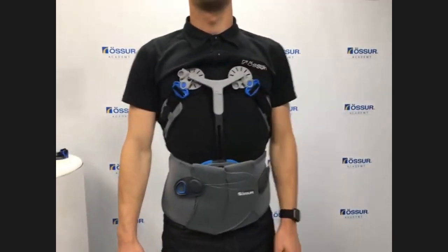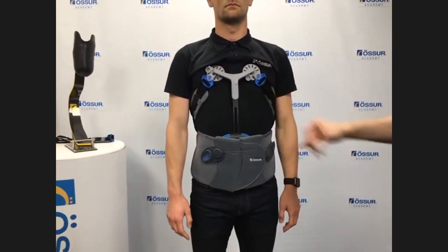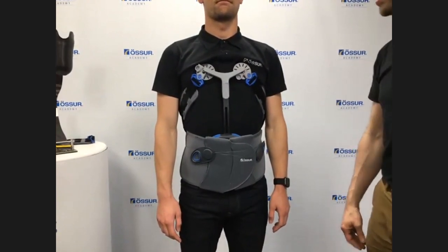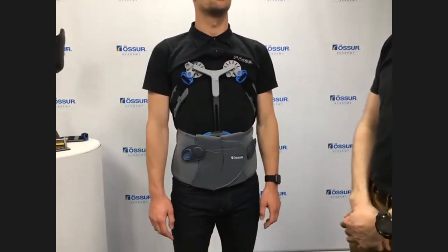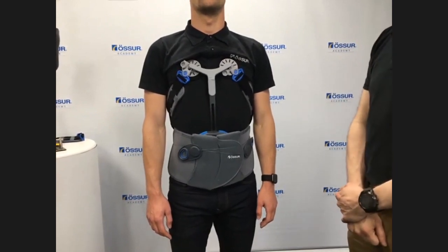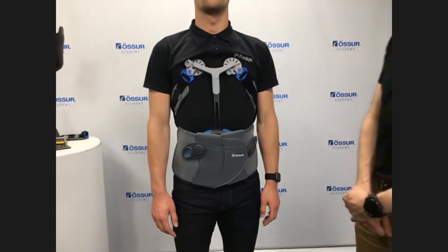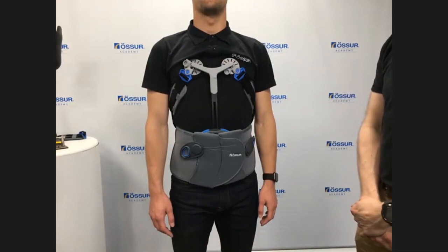Now, one of the good ways that this is stabilizing the patient is you get a much higher level of control over the anterior thoracic extension. So especially in flexion, you're getting very, very high levels of control. It also means that you haven't got those straps over the shoulder, which sometimes can feel quite constrictive. So it's a really good configuration where you want a higher degree of control, but it actually feels a little bit easier for the patient. Okay, so this is a moderate to high level of control for this system, and we can then change the setup according to whatever we need to include the over-the-shoulder straps as well.